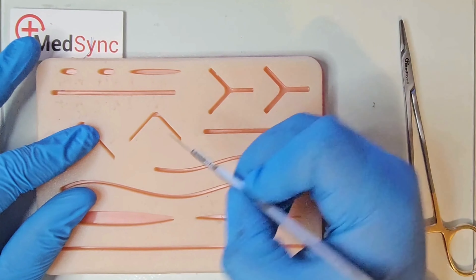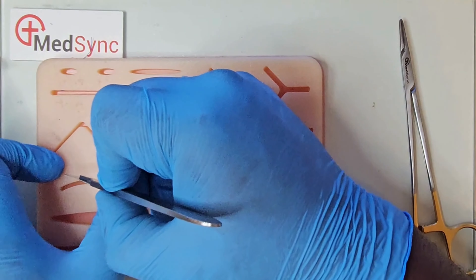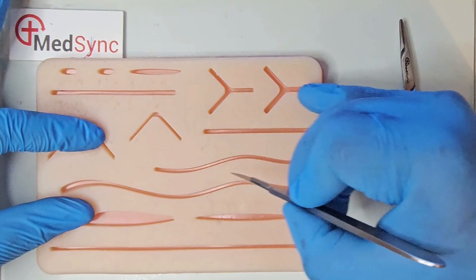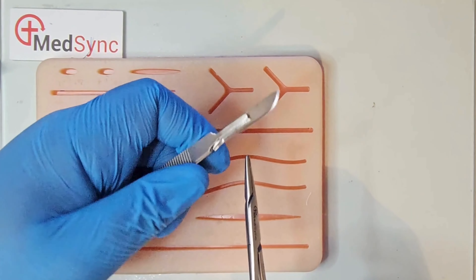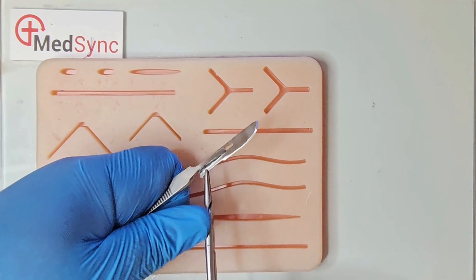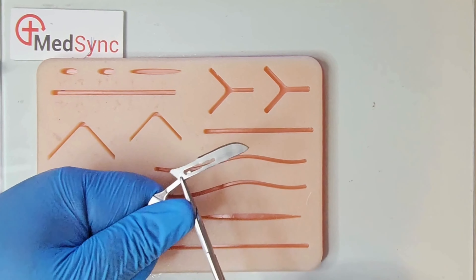For added control, your little finger can provide support and pivot. You apply distracting force perpendicular to the direction you are cutting. You never cut toward your fingers. Remove the blade by lifting it at the base out of the groove and retract the handle, keeping the blade within your field but pointing it away from any direction that could cause harm.